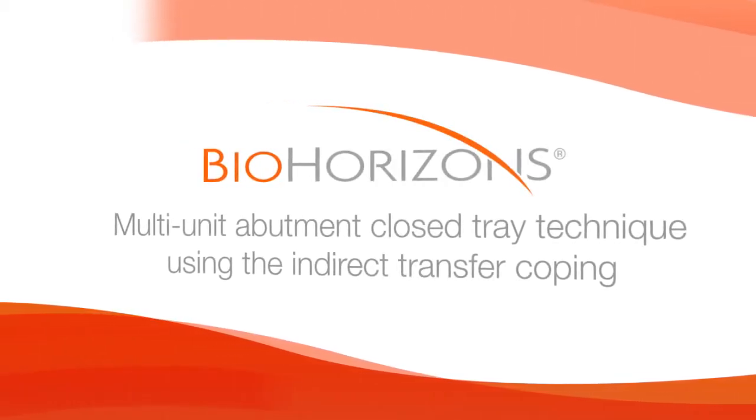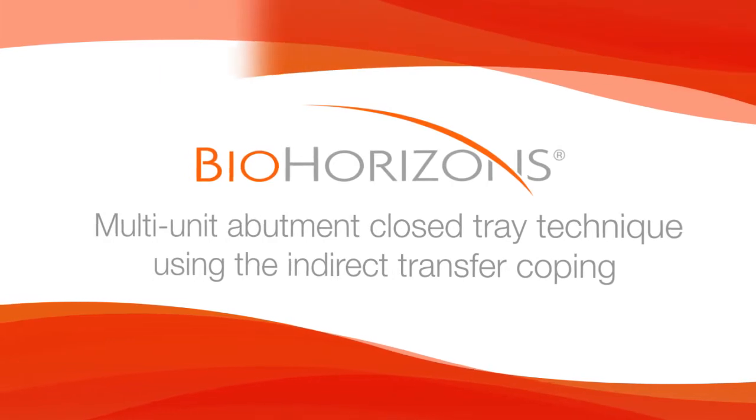Multi-unit abutment closed tray technique using the indirect transfer coping.